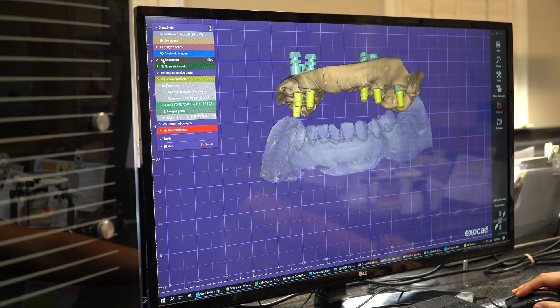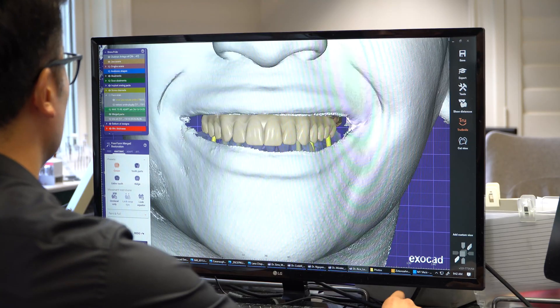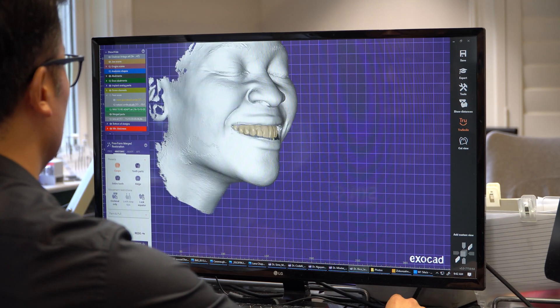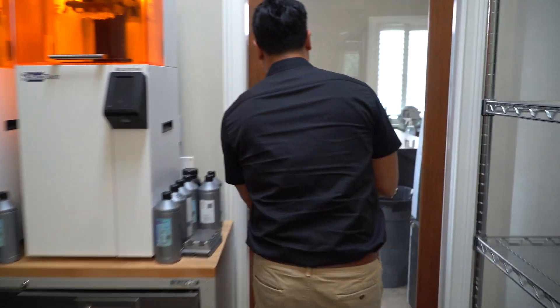He'll send those to us through our HIPAA-compliant portal. We'll be able to download all of those records, merge everything together, place the implants to the arch form that we already have created. We'll also be able to perfect the occlusion, and any other adjustments that we need to make can be made at this time. That gives us everything we need to produce an excellent result for Lana.